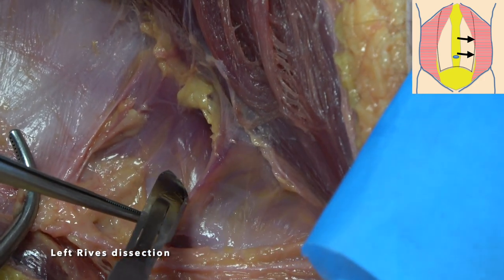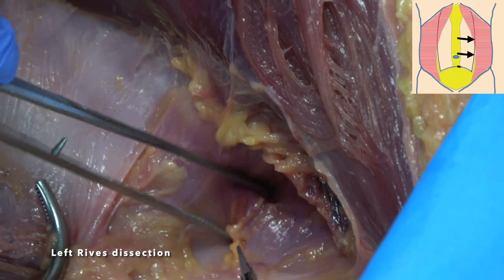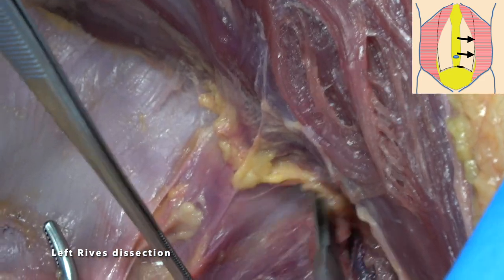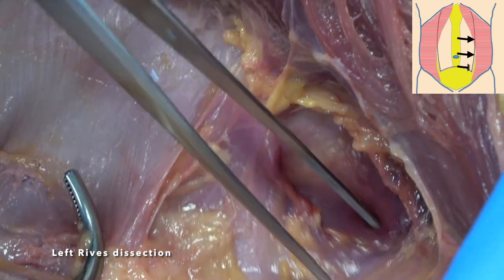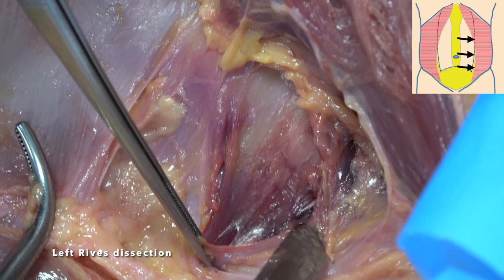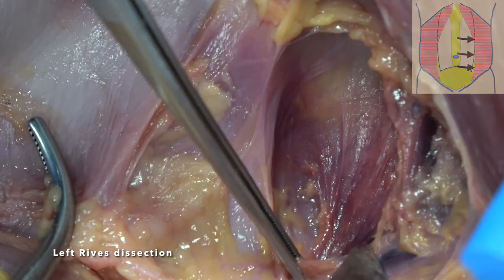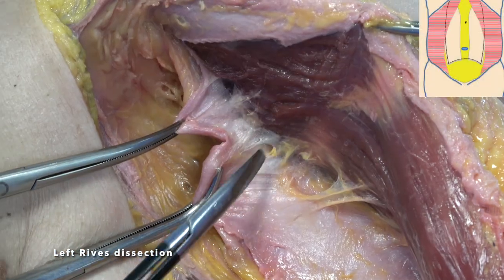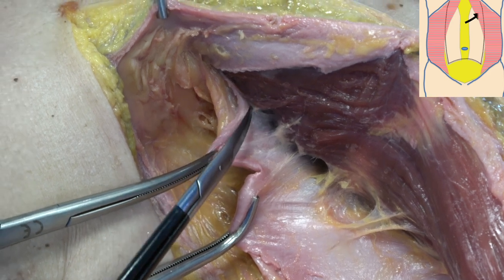Laterally, the epigastric vessels are retracted within the rectus muscle. At this level, we should leave the fat attached to these vessels to avoid their injury, but this will also give us the right plane on the retroinguinal area to reach the Cooper ligaments.